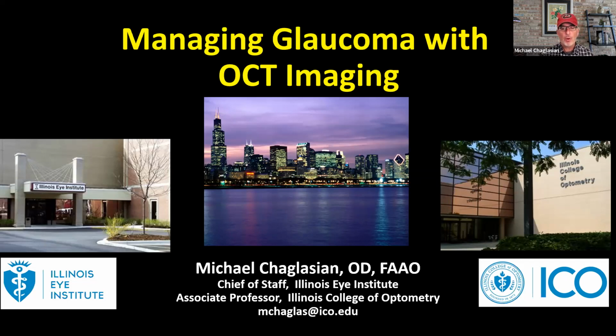And I saw the poll. I think it's great that well over 50% of the optometrists here have an OCT in the office, but there's still lots to learn here for those of you who might not have immediate access to an OCT. There's lots of general principles. Perhaps you're working with someone or referring your patients out for OCT. So I'll keep it very broad-based, and we're here this evening to just have everyone be more comfortable with their glaucoma patients. That's what I've been doing for 30 years. I know, Joe, you've been doing a lot of that with glaucoma and neurodisease and many other things as well.